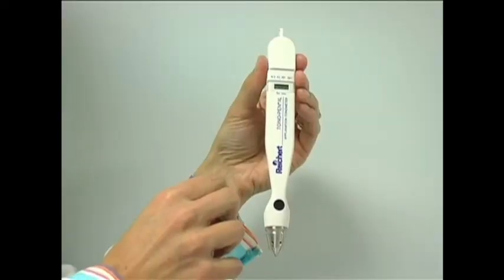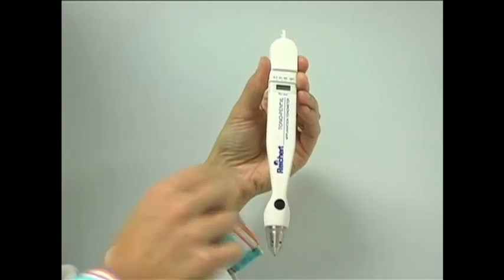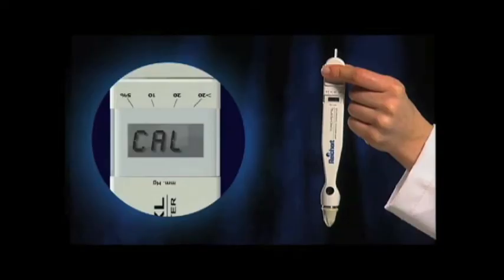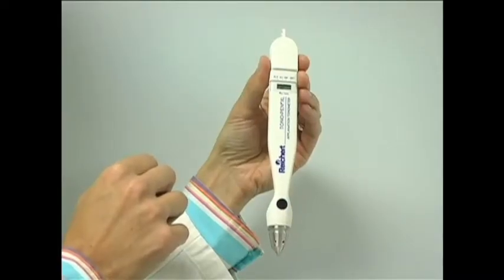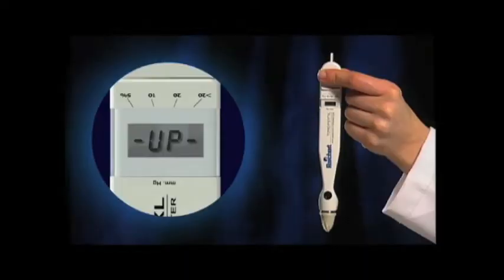To calibrate the tonometer, keep the Tonopen pointing straight down and rapidly double-click the operator button. Listen for the beep, and the LCD screen will say Cal. Once you see Cal, keep the Tonopen straight down for 15 seconds until you hear the beep and see up on the LCD display.